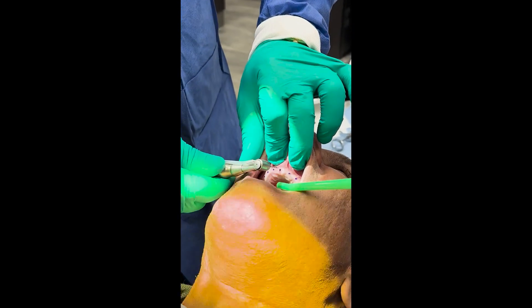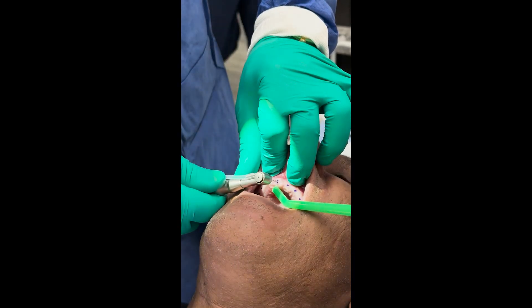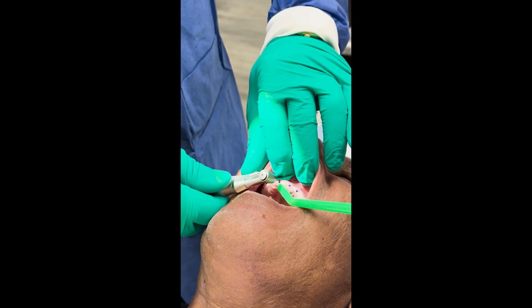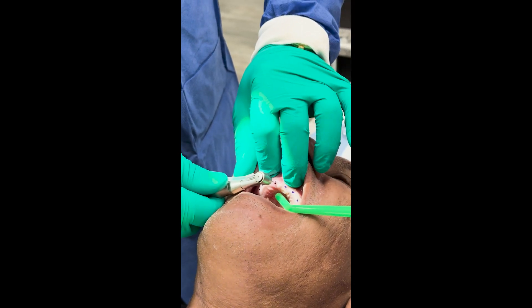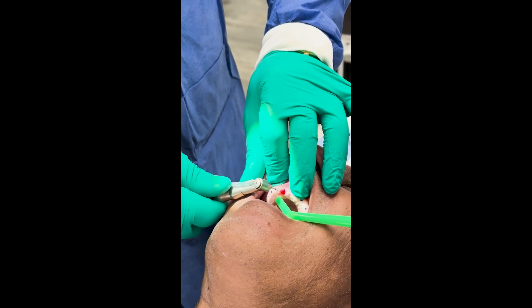So we're going to go ahead and make our pilot hole. Let me know if anything hurts. A little bit of angulation to the palate because you see that indentation — I'm holding my finger here as a buffer.